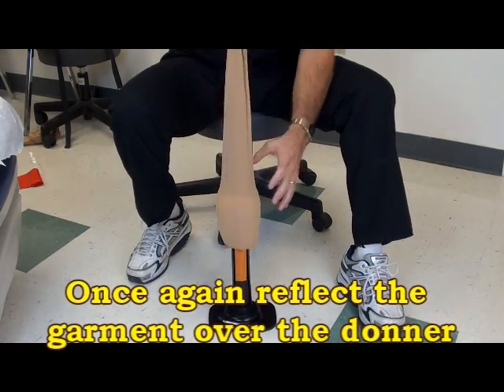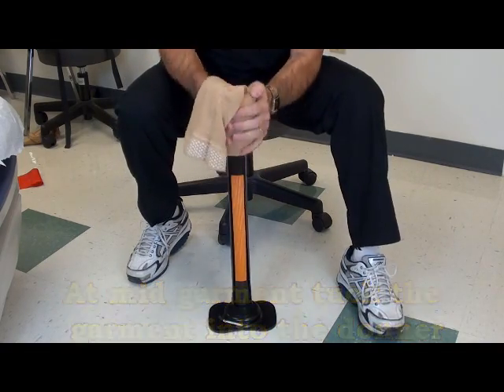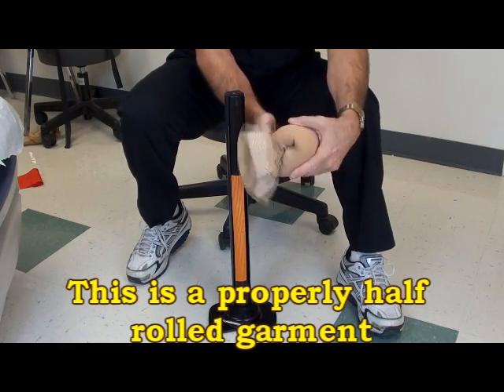Then once again reflect the garment over the donner. At mid-garment, tuck the garment into the donner, then roll — not pull — the garment off of the pole. This is what a properly half rolled garment looks like.